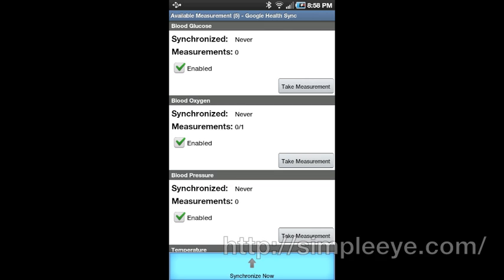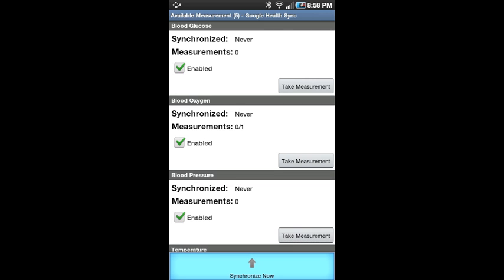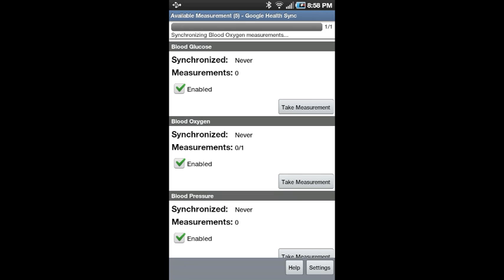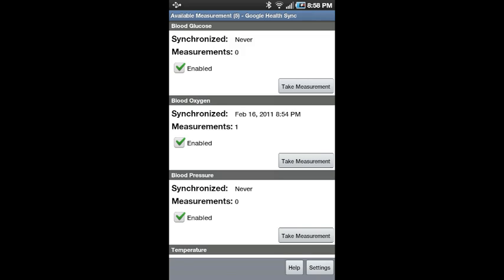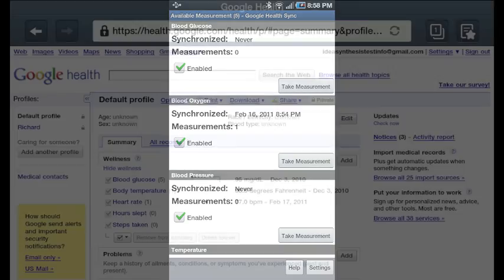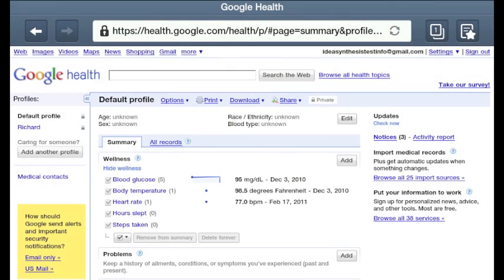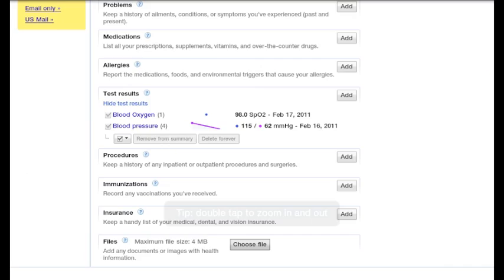Tap the Menu button, then tap Synchronize Now to send the measurement to Google Health. Simple Eye Google Health Sync can also send the measurements automatically. Tap the Settings button to configure automatic synchronization. The new measurement can now be seen in Google Health.